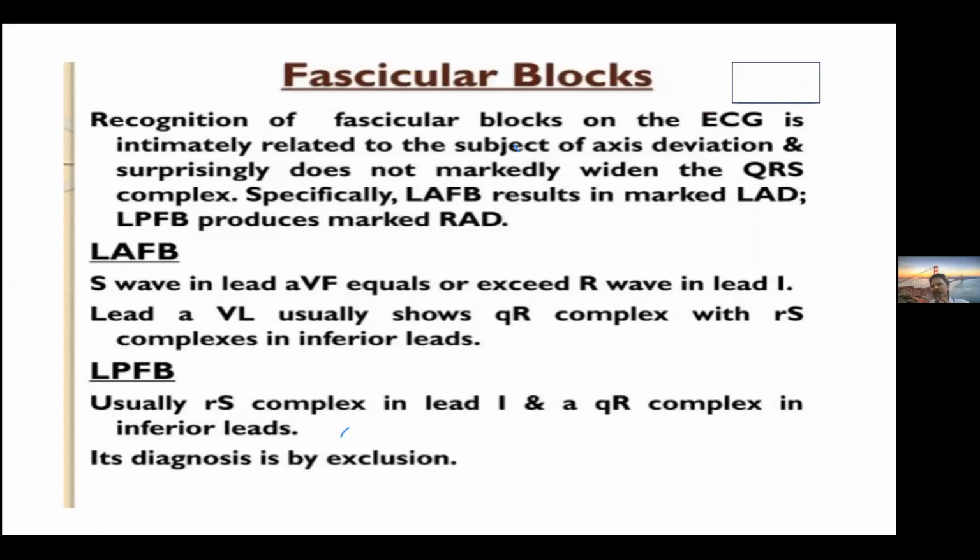So moving on from the gross conduction block, that is right bundle and left bundle blocked, you know that it is simple. When you see an M pattern in V5, V6, it is left bundle branch block. RSR pattern in V1, it is right bundle branch block. As simple as that. Most of the time RBBBs are innocent, but when you see a Q wave and ST elevation with RBBB, you have to panic and act urgently, because the patient will have a proximal LAD occlusion and will present with an anterior MI, which will be life-threatening unless it is intervened very quickly.